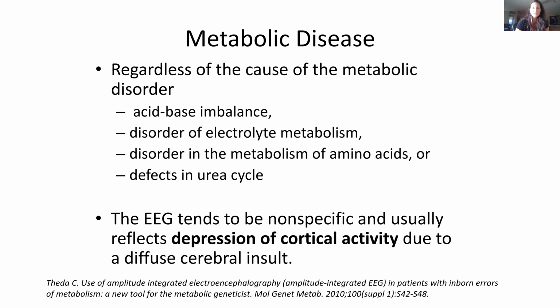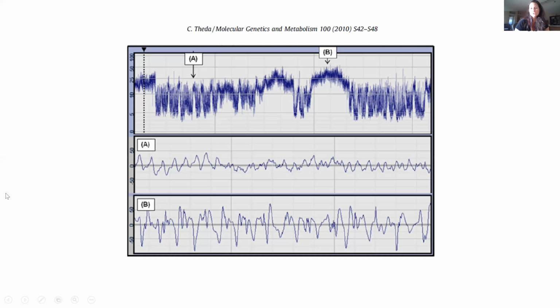So the other thing that these babies oftentimes have that we know are seizures. And so this again was from her paper in 2010, just showing these very extreme high voltage seizures and just recurrent repetitive status epilepticus, which we also know is oftentimes a feature or a presenting clinical finding for these babies.